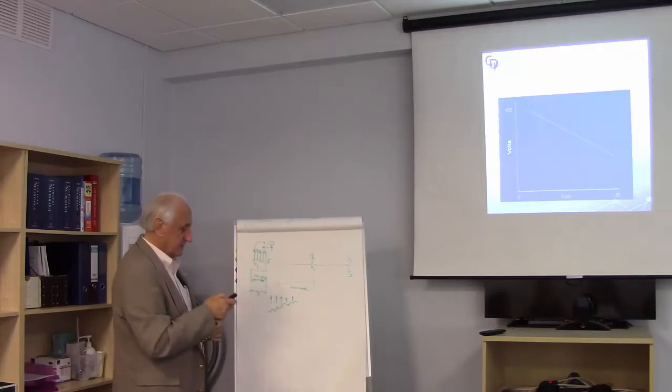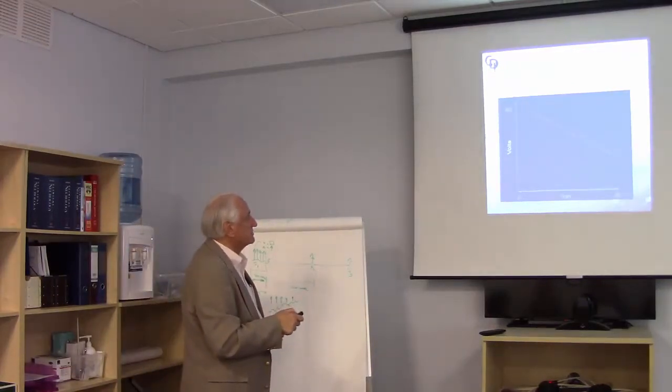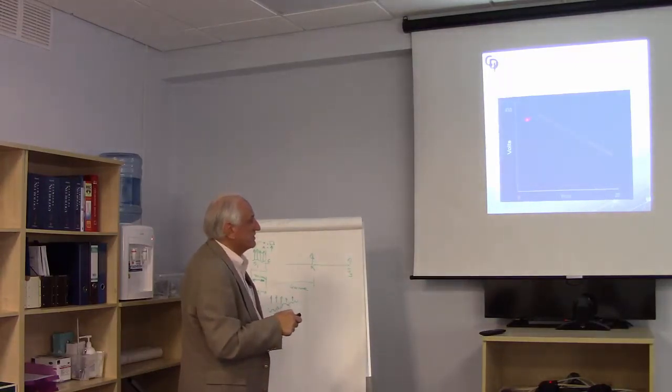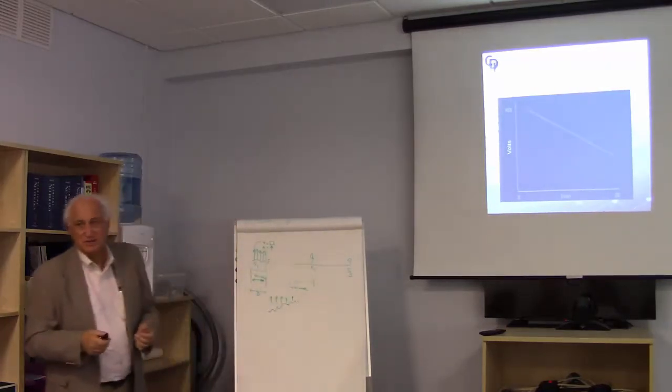Motor potentials in pediatric patients require a higher stimulus. This happens to be in terms of volts. This is old data. And this is the patient's age. So you can see when you're down 1 or 2 or 3 years, the voltage has to be higher. As you age, the stimulus intensity that you require to produce this will fall off. This is a general concept.